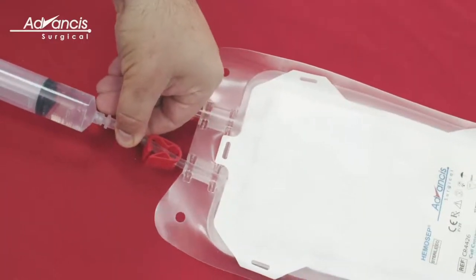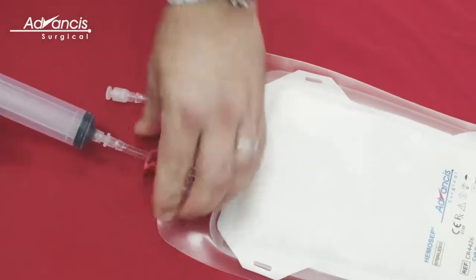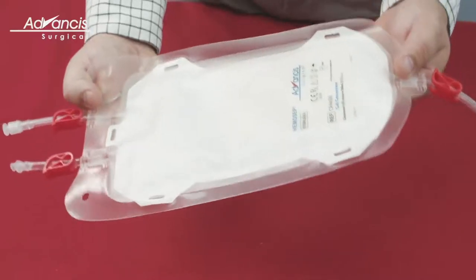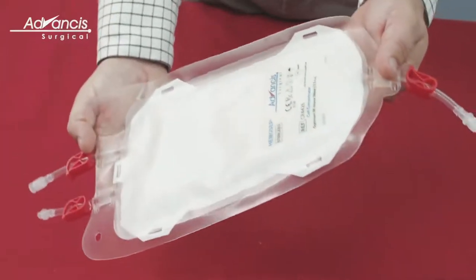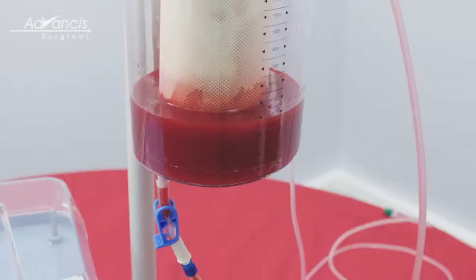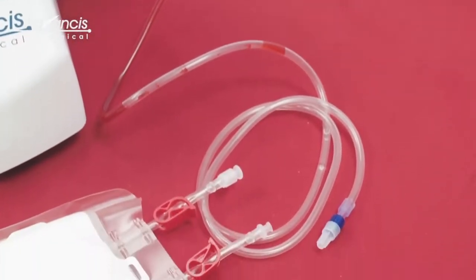Prime the Hemosep cell concentrator bag with 100 milliliters of normal saline and close the clamp. Gently rock the bag to ensure the membrane is completely wet and the fluid is absorbed into the center of the bag. Blood must be added to the bag for processing within three minutes of priming with the saline.